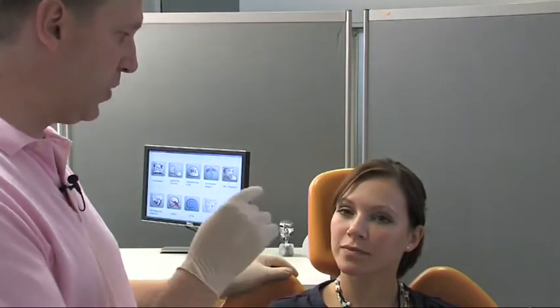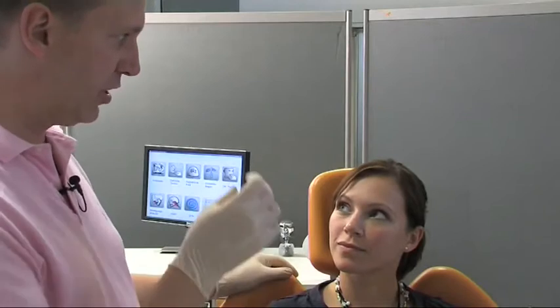It could be the way you bite. Just biting your teeth together we call static occlusion. Or biting with movement, which we call dynamic occlusion. Or it could be caused by grinding your teeth together. Or other factors, such as swallowing patterns. We know that you have pain, and we want to find out if this is being caused by your static occlusion, the dynamic occlusion, or by grinding your teeth. We will do this by an electronic analysis.